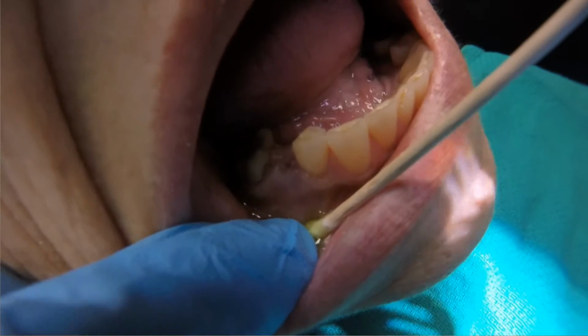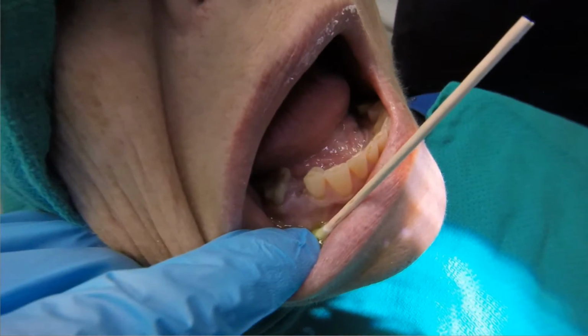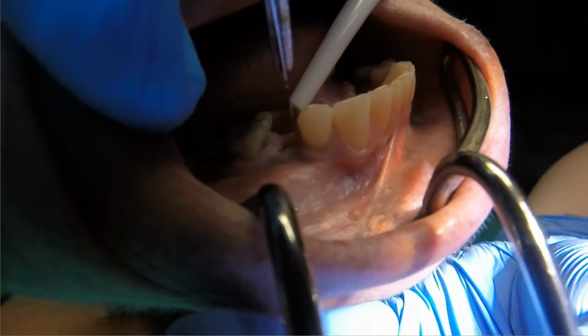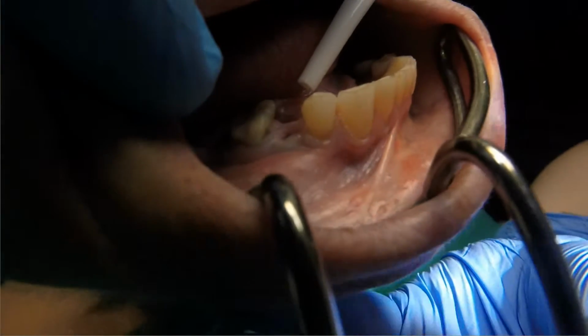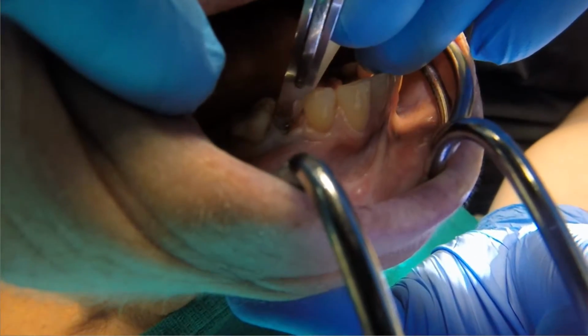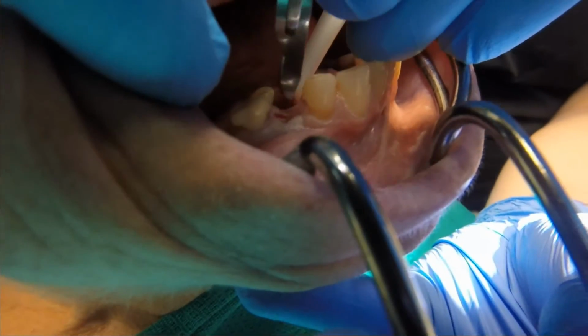So now we go to the video, and in this video the goal basically here is to perform a stage 2 procedure. So what I like generally doing is doing an H incision. You'll see what I mean by an H incision. And the beauty of this, it's basically like a little bit of a trap door.